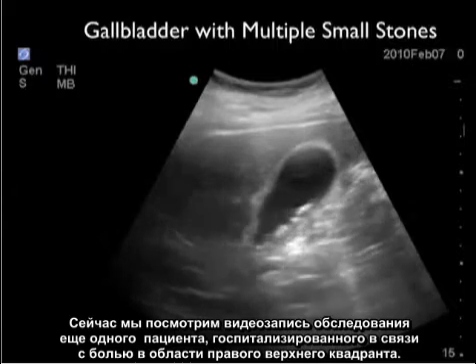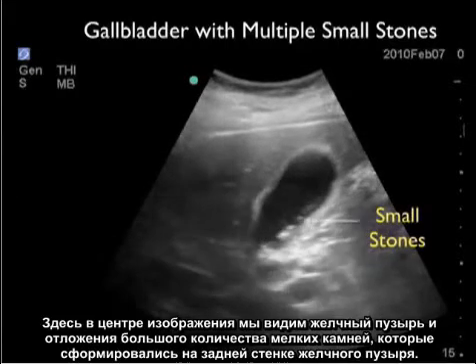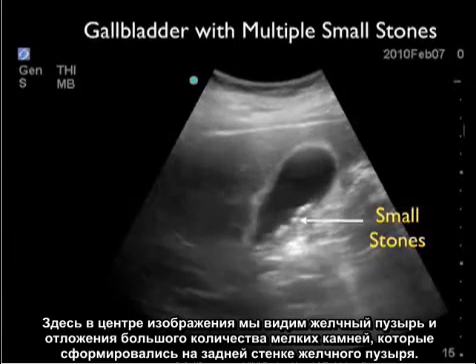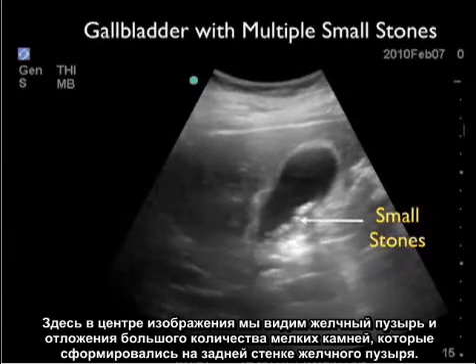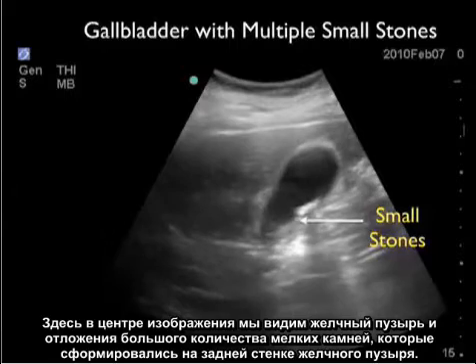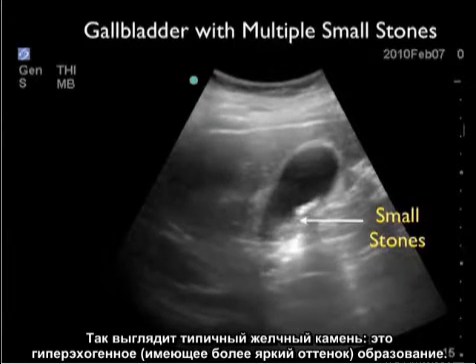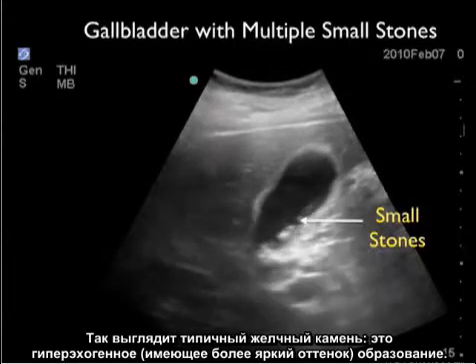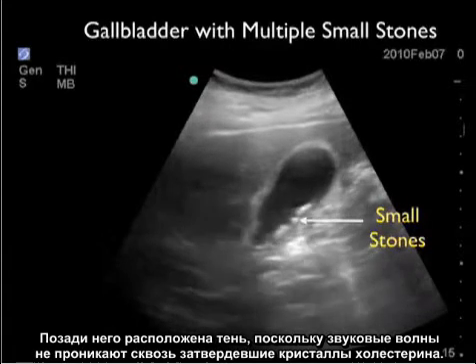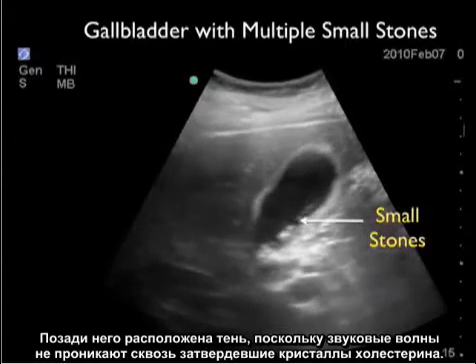Here's another video clip, again from a male presenting with right upper quadrant pain. We see a gallbladder in the middle of the image, and notice the layering out of multiple small stones on the back wall of the gallbladder. We see the characteristic appearance of a gallstone — it has a hyperechoic or bright appearance, and we can see shadows coming off the back as the sound waves can't permeate the hard cholesterol crystals.